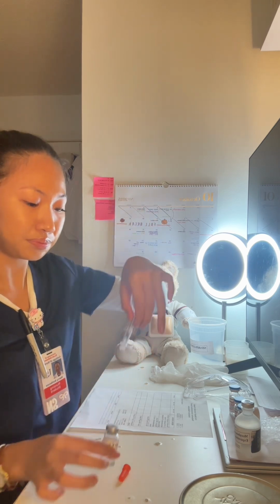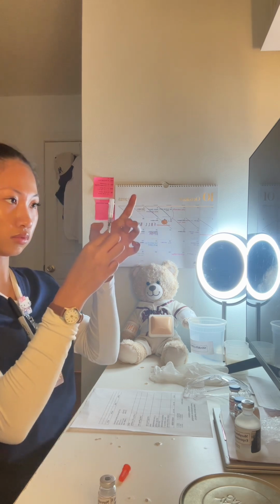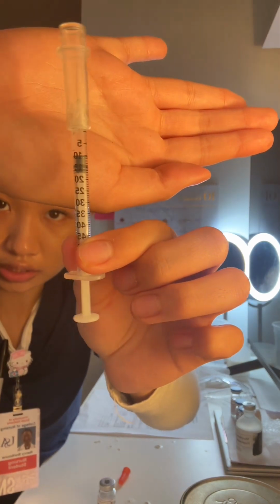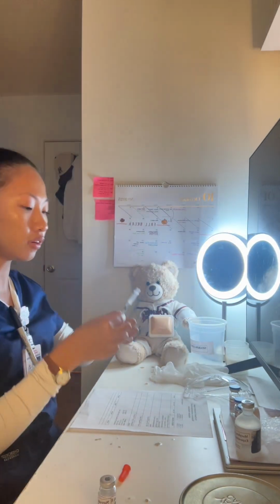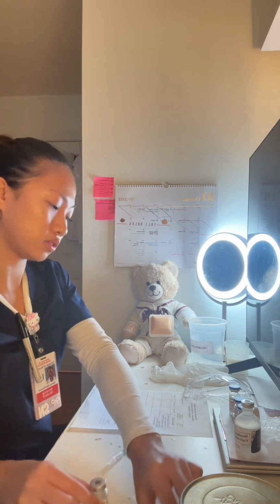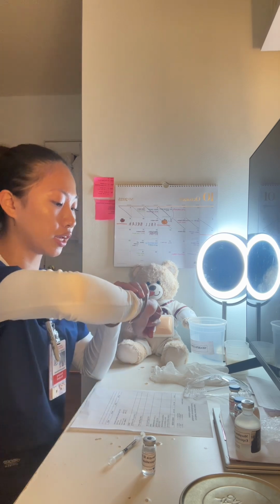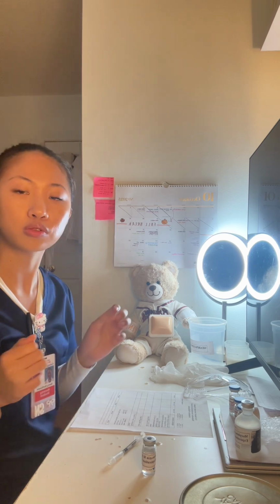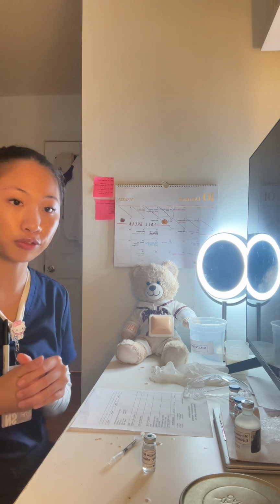I'm gonna pop this safety cap on, making sure I have no air bubbles. And then I have 10 units of insulin in my syringe here. So I will be giving this subcutaneously 30 minutes before his meal. So I'm gonna go ahead and check. Yep, it's almost meal time. He still hasn't received his insulin shot yet. And insulin is used to regulate the patient's blood glucose level. So now that completes my first check of accuracy.